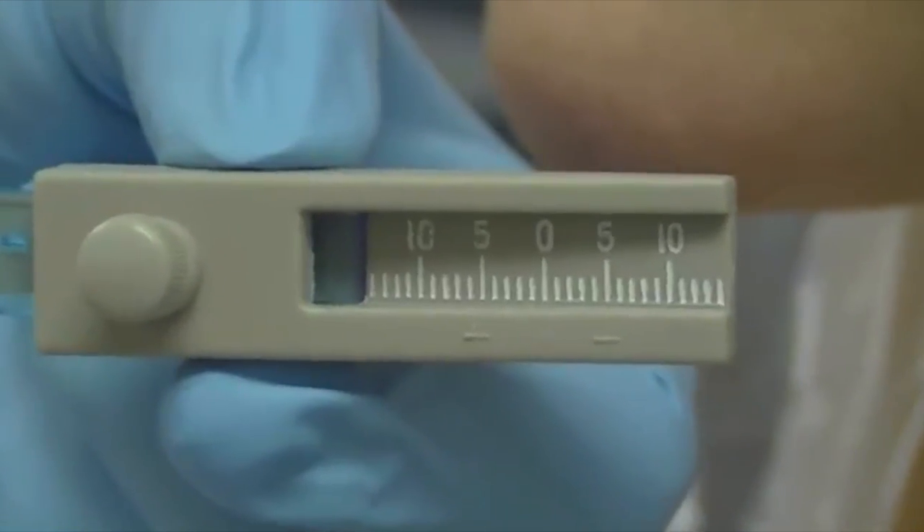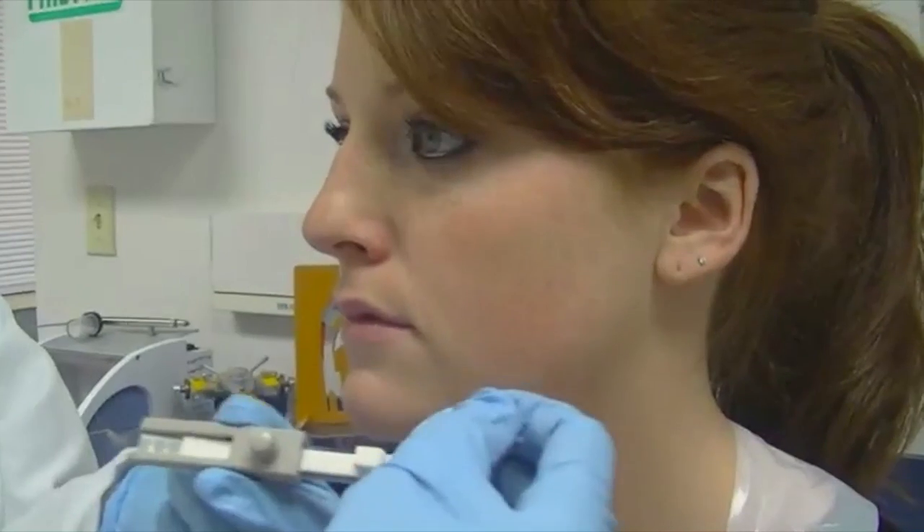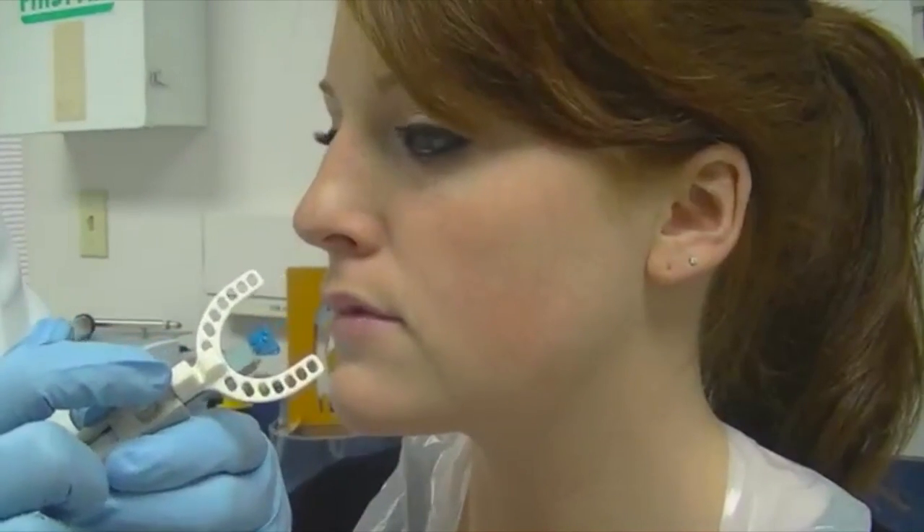On the upper one, this is going to have to be loosened because we are going to place the — in this case — the 5mm fork. So the first thing you want to do is loosen that set screw, put the edge of the fork in, and then while it is still not tightened, place it in the patient's mouth.